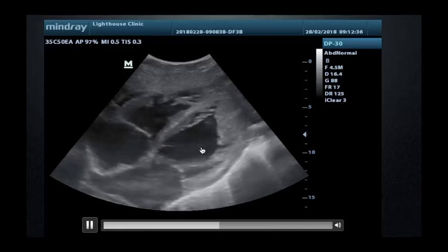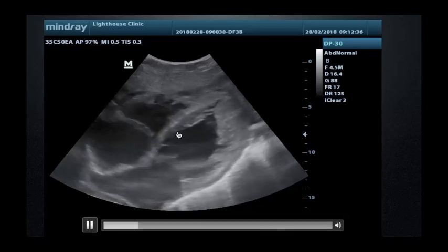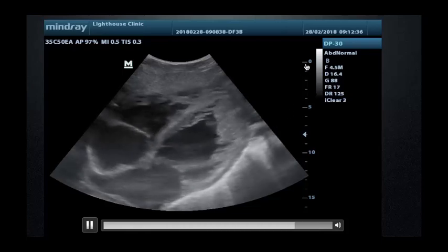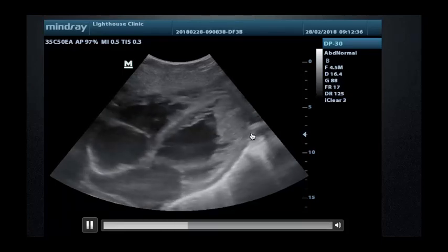But then how is the thickness of the left ventricular wall? The best way to measure that, if you want to measure it, is usually the septum. But in this case, it is even a little bit more pronounced on this side. You see that the wall is very, very thick. This between the two white lines is 1 centimeter. So this is certainly around 2-3 centimeters, and here it is also thicker than a centimeter and a half.